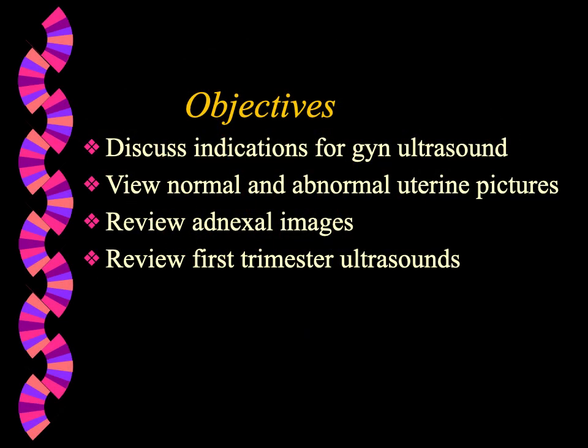We're going to start our objectives today by discussing the indications for GYN ultrasound. We're going to look at some normal and abnormal uterine pictures. We're going to review some adnexal images, and then we're going to review first trimester ultrasounds.